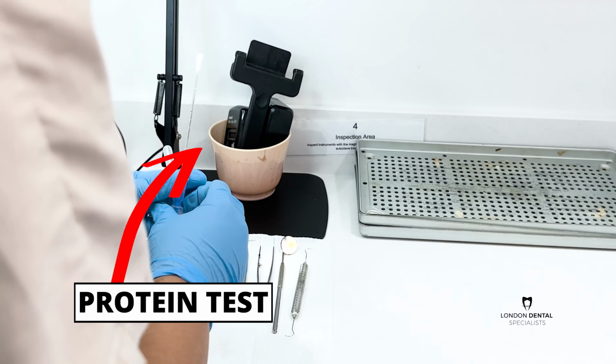So she's just going to take a random selection of instruments. She is inserting that swab into hard to reach and hard to clean areas, because those are the areas that could easily be missed by the ultrasound bath. And she's going to check in a second whether there are any proteins on that swab.